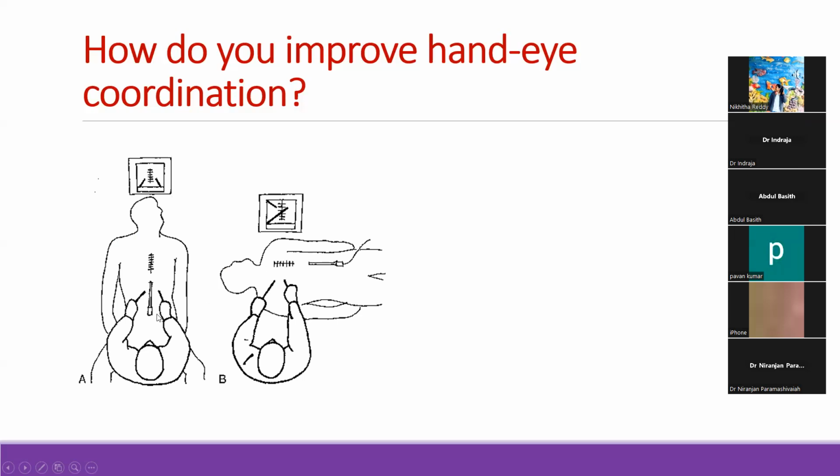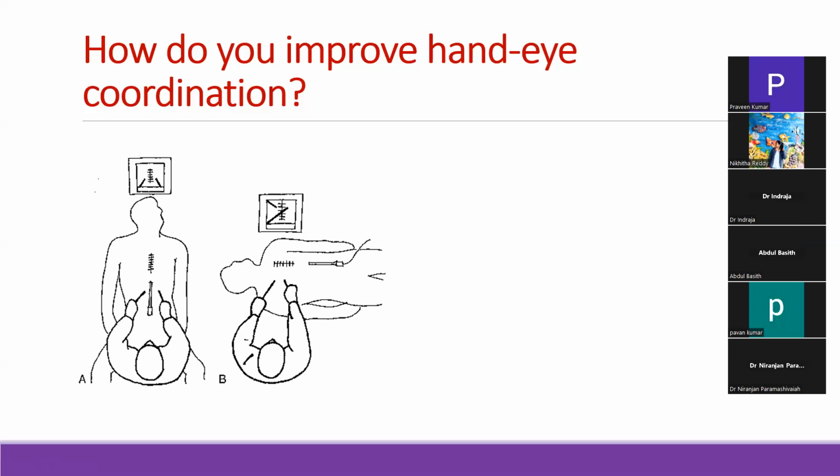If your eye is here and your camera is looking at you, just try it sometime. It's almost impossible to get the hand-eye coordination. Even after 3 decades of work, if I have a camera which is coming towards me and I'm standing in one direction, it's almost impossible. So this alignment, your eye, organ in question, the camera, your eye is your camera, remember? And the monitor must be in one single line. Anything else? What is triangulation to you?